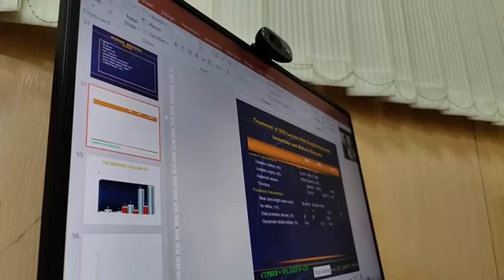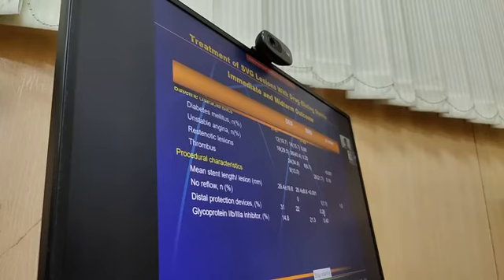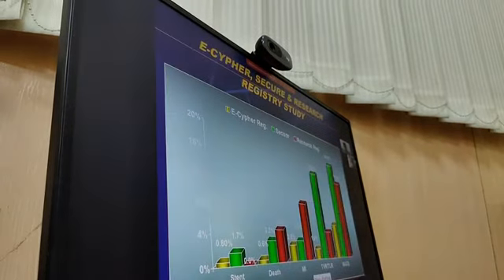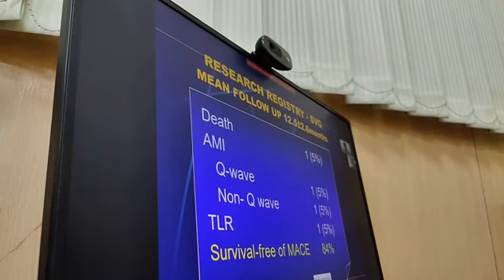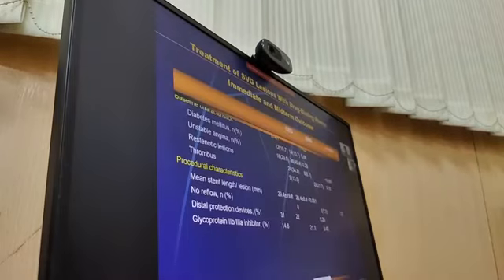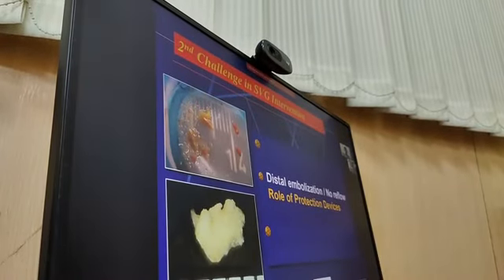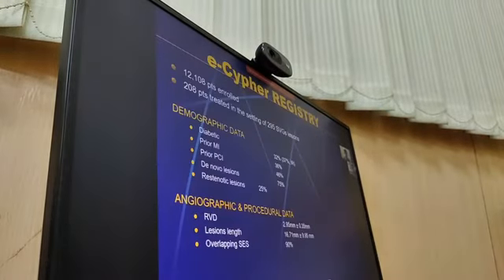Obviously, we will always use drug-eluting stents because they are much more easily available these days. Bare metal stents are very rarely used, if at all. I would say they are absolutely not used. So this comparison is only for theoretical purposes. First they showed the superiority of stents in the first slide, and then they showed the superiority of drug-eluting stents over bare metal stents in prevention of restenosis. So stents have to be used always. This was when there was a lot of cost difference, and they were very expensive, 1,25,000, versus 30,000-40,000.